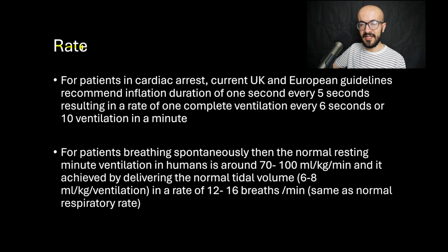Regarding the rate of the ventilations given, so for patients in cardiac arrest, current United Kingdom and European guidelines recommend inflation during 1 second every 5 seconds, resulting in a rate of 1 complete ventilation every 6 seconds, or 10 ventilations in a minute.